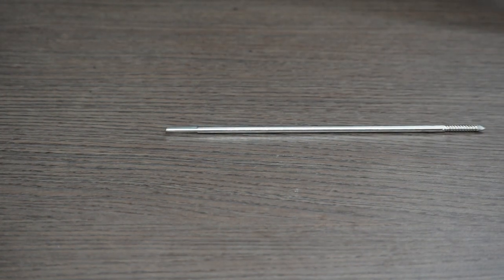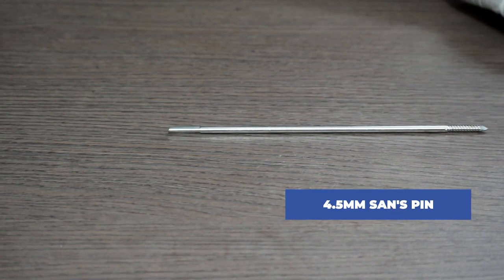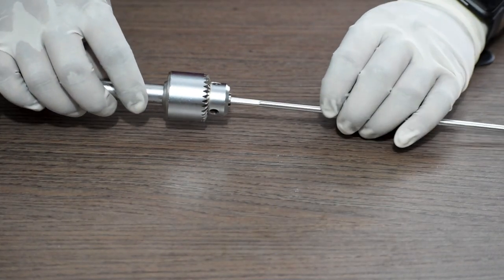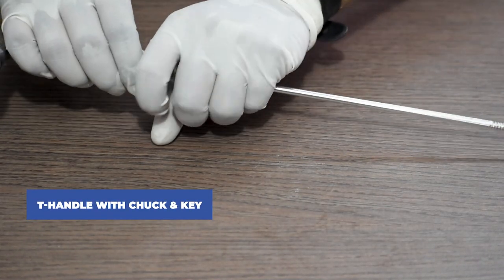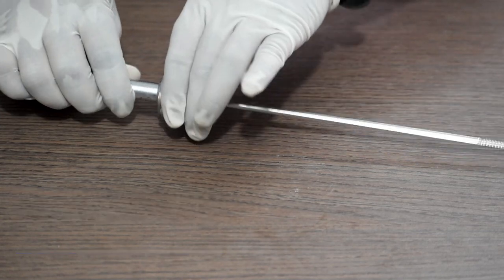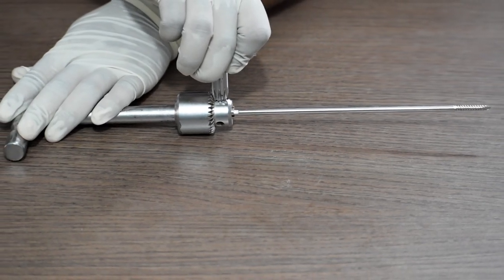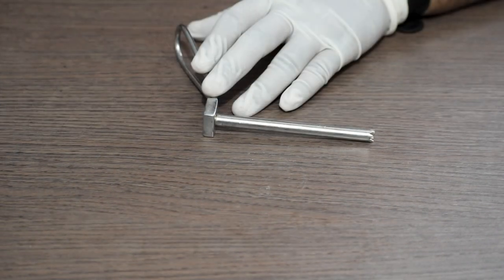Then we will take a 4.5 mm Schanz pin. We will attach the 4.5 mm Schanz pin in the T-handle with chuck and then use the key to tighten this Schanz pin in the T-handle.